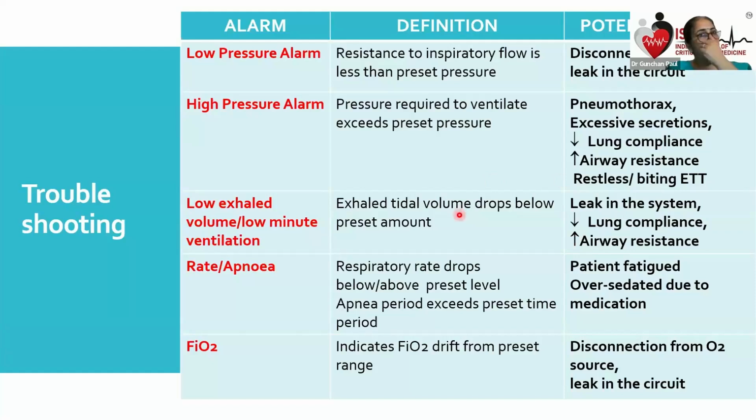So I have seen a patient going into respiratory arrest, peri-arrest condition, almost cardiac arrest, because the minute ventilation alarm went unnoticed. Now, when we wean the patient, we put the patient on CPAP. We do not give any tidal volume. We do not adjust any respiratory rate. We give only pressure support, and that is determined. The rate and the tidal volume are determined by the patient. So apnea alarm must be set when there is CPAP. Backup ventilation must be set.